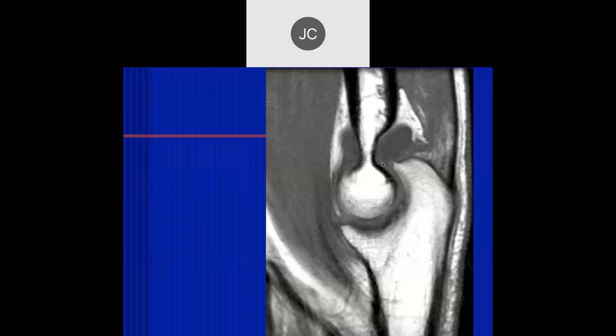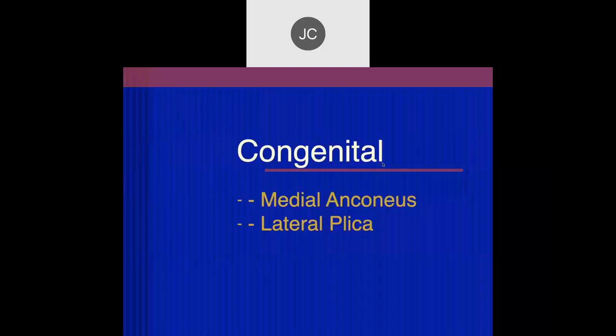On this T1 sagittal image there looks like displacement of the fat pads - a joint effusion. That's just anatomy. Let's talk about a few congenital things: one is the anconeus epitrochlearis muscle, and the lateral plica.